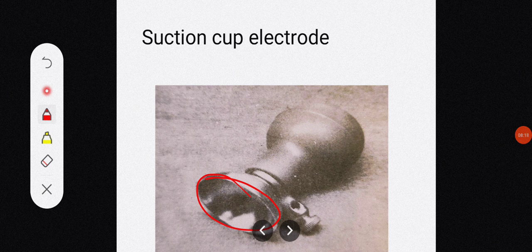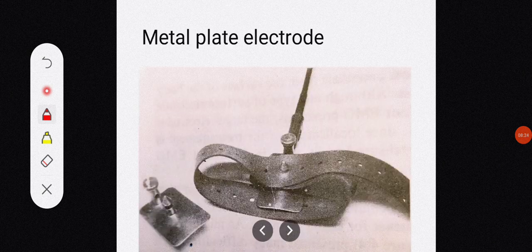Now a number of attempts were made so that this problem can be overcome, including the use of adhesive backing and a surface resembling a nutmeg grater, which can penetrate the skin to lower the contact impedance and reduce the likelihood of this slippage of the electrode. So all the preceding electrodes suffer from a common problem, that is, they are all sensitive to movement, some to a greater degree than others.